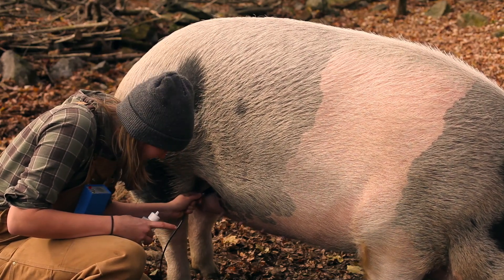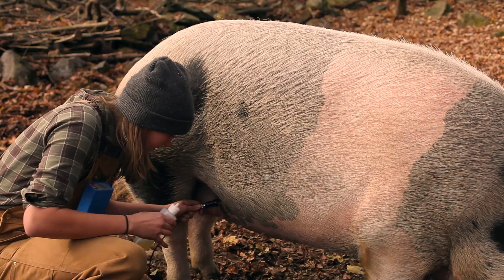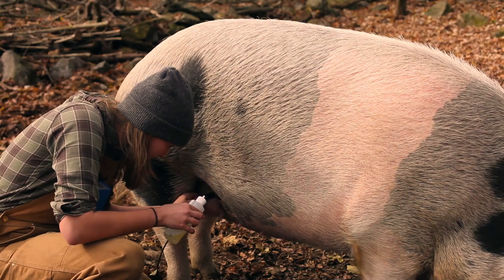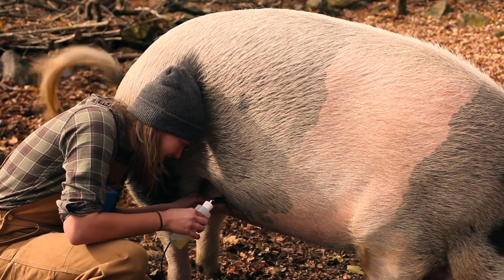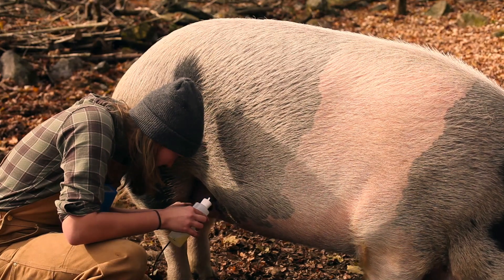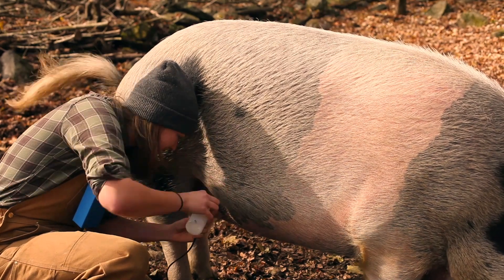The bladder is towards the back, so you want to have your probe pointing towards her front shoulder. So you just keep moving around. You can hear it starting to change, so I'm just gonna add some more oil to get better contact.